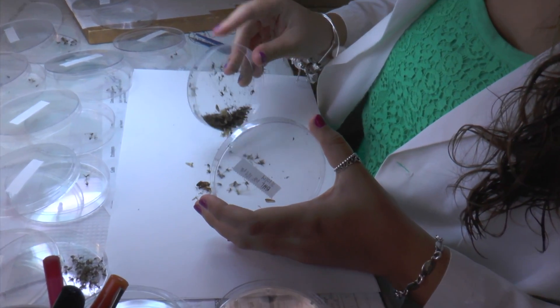Can you tell where a trap came from without even looking at the label? Sometimes. There are certain locations that have a lot of one mosquito, so you can definitely know which trap you're doing. But sometimes it's hard to tell unless you know by the label.